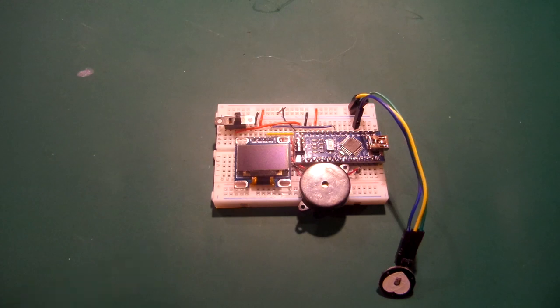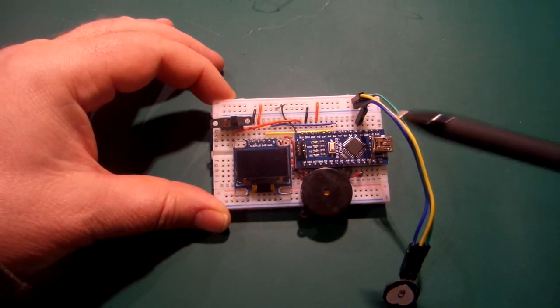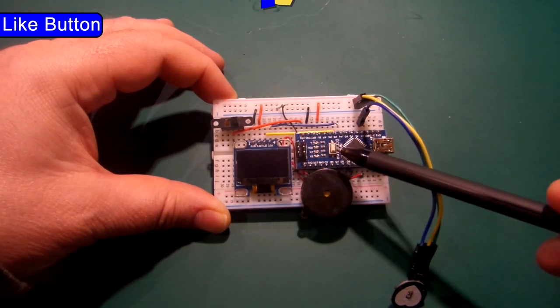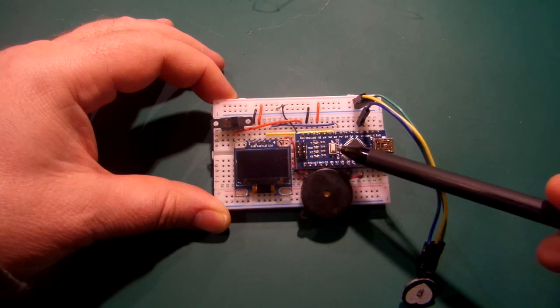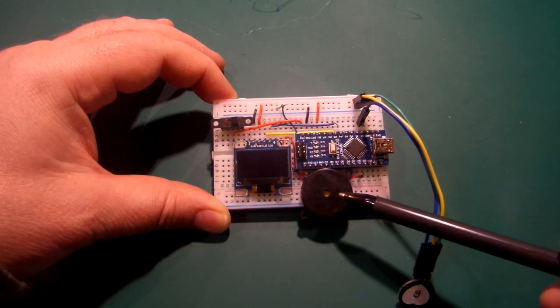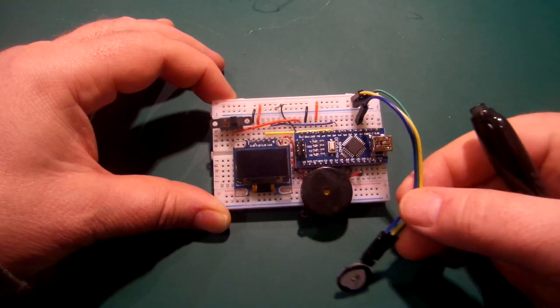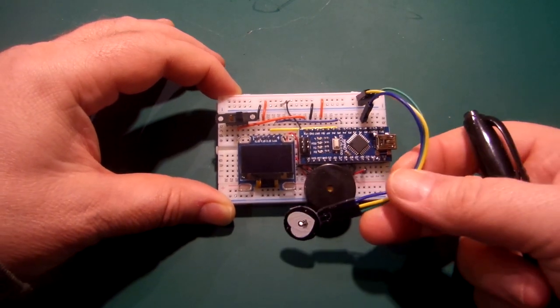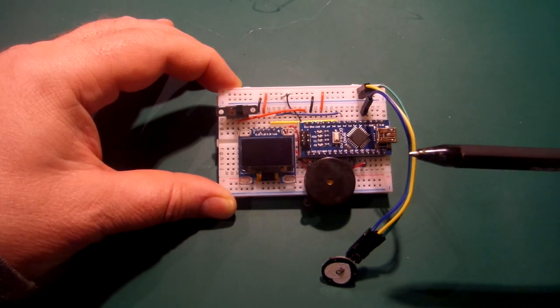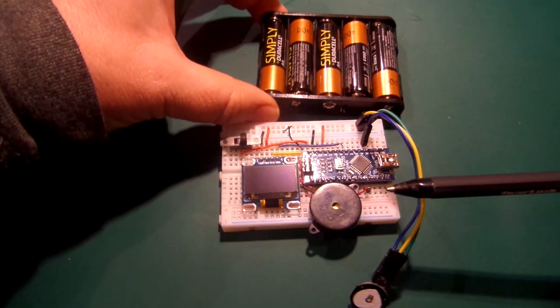So this is our breadboard design of the actual circuit. It's got four or five main components — you include the switch. We've got the Arduino Nano itself, the OLED screen, the little piezo sounder, the actual heartbeat sensor just going out of shot a little bit, and a switch to turn it on and off. You could count the battery pack as another component as well, perhaps.